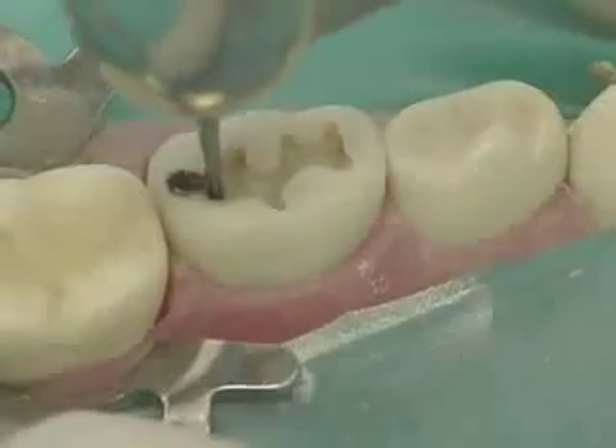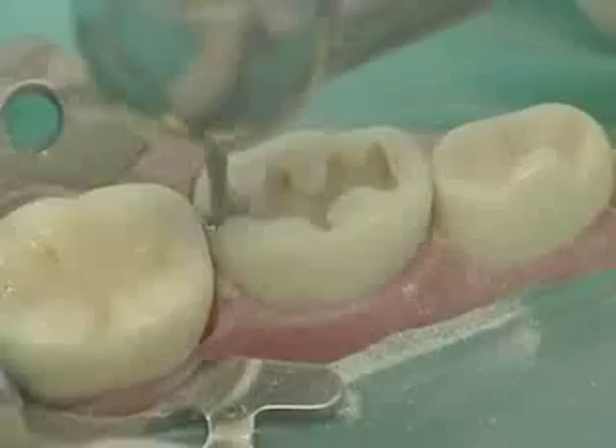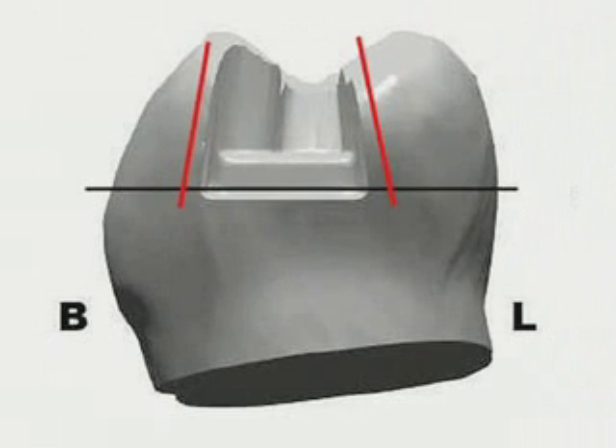Switch the handpiece to the 245 tapered fissure burr. This burr has a 3 millimeter cutting length and is used to establish the gingival floor depth. Create gingival divergence of the lingual wall. The proximal box should parallel the lingual surface and the buccal wall should parallel the buccal surface. The shape of the axial wall should follow that of the external surface.